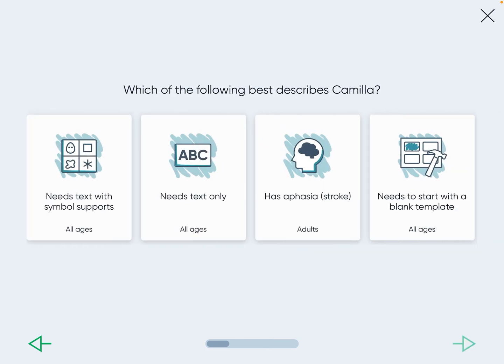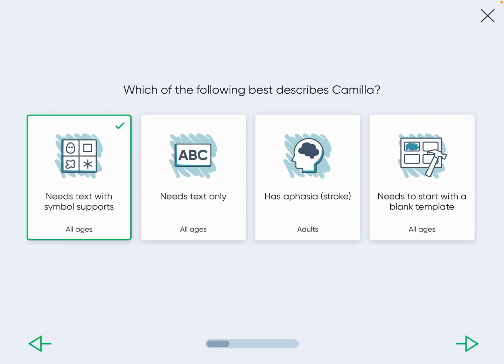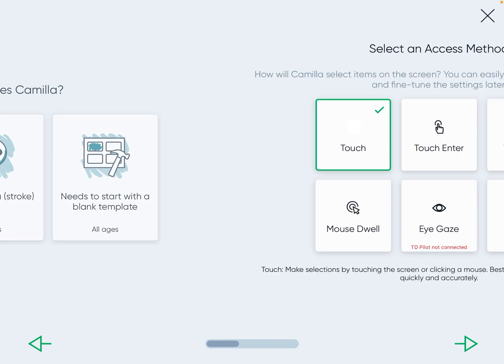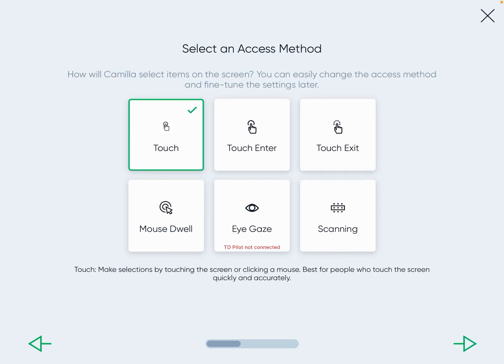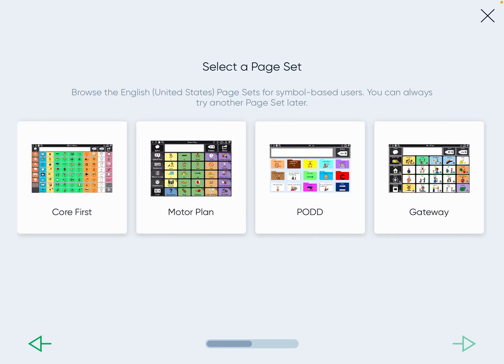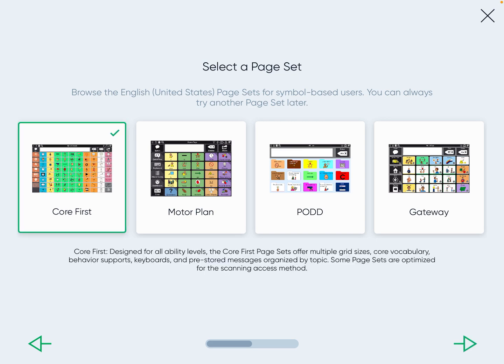I always do text support with symbol supports for our age group, unless there's something else going on, but usually I do that for our age. Touch, unless told otherwise, is the access method — how they're going to access the device. For this one, we're going to click Core First.